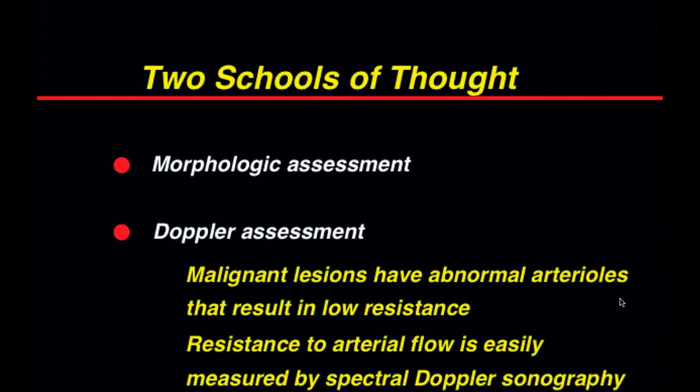Furthermore, we know that it is ridiculously easy to measure resistance with an ultrasound machine. We find an artery, we take a spectral signal, we measure the resistive index. It's 30 seconds of work. We can definitely measure the resistance quite easily. So is measuring the resistance the issue?